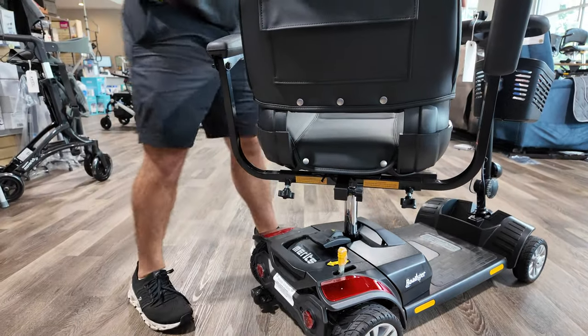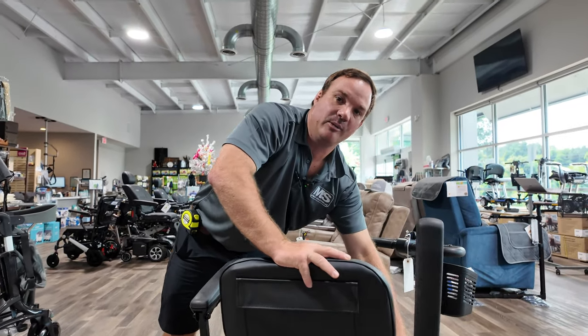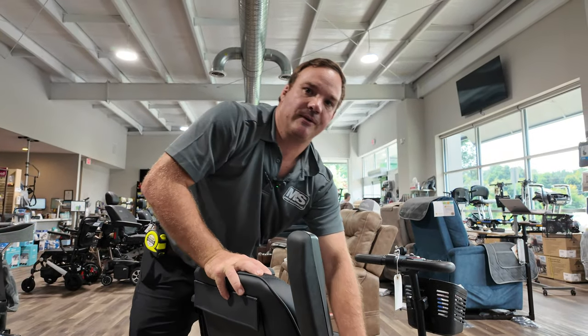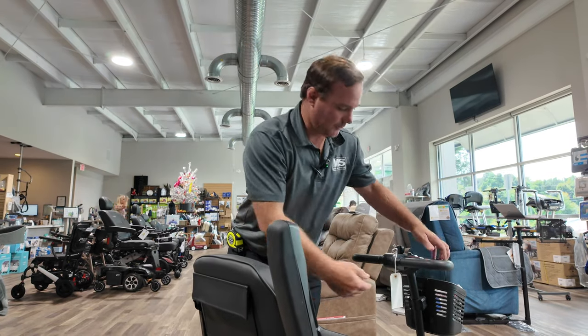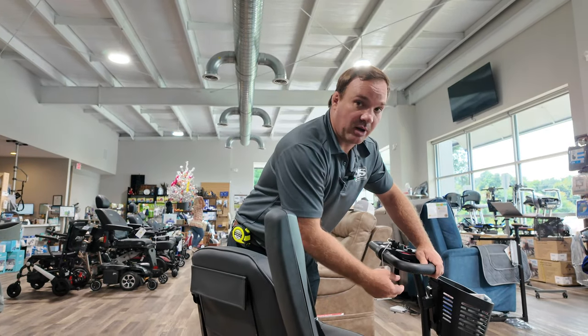If you have a mobility scooter and it's beeping at you, count the beep codes — that usually helps us figure out what's wrong with it. Some beep codes can be as easy as it being in freewheel or having the charger plugged into the unit.